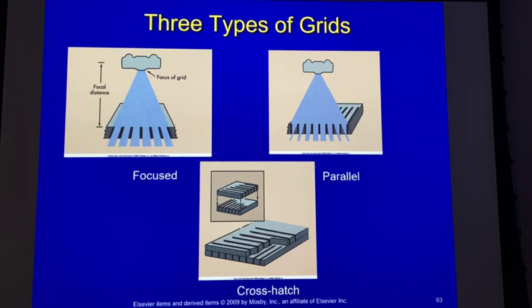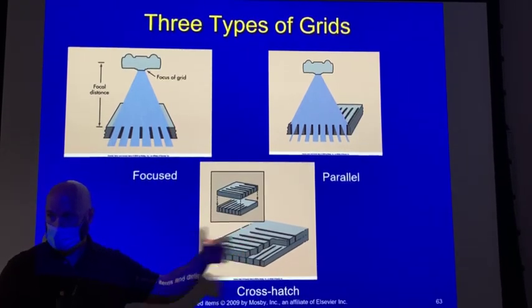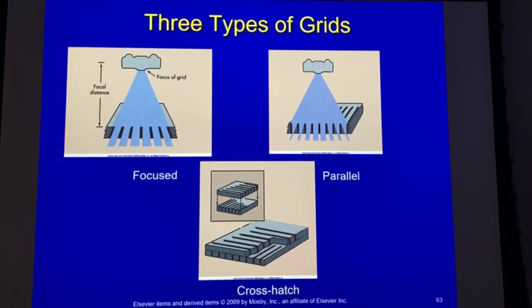Yes? Whenever you're talking about patient latitude, you're still talking about latitude as being possibilities, right? Positioning latitude, yes, is possibilities. Not latitude as in radiographic technique or anything. So you have more positioning possibilities on a parallel than you do focused, and more on focus than crosshatch? Correct. Especially more on focus than a focused crosshatch. There's no positioning latitude for a focused crosshatch. Exactly. Yep.